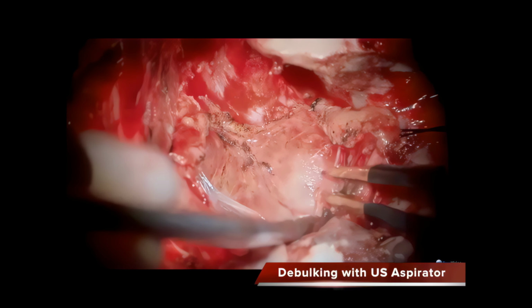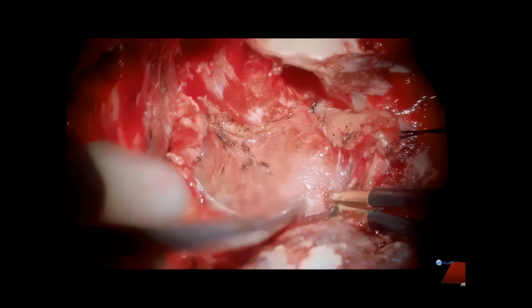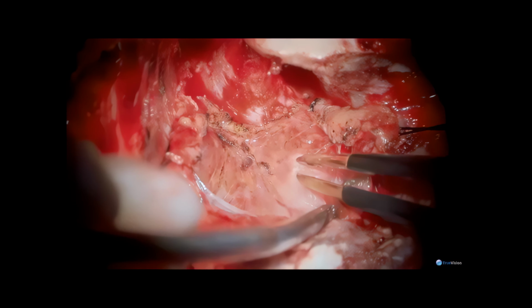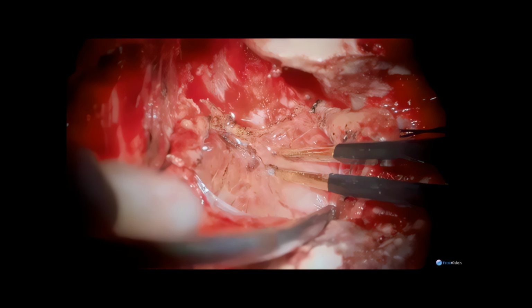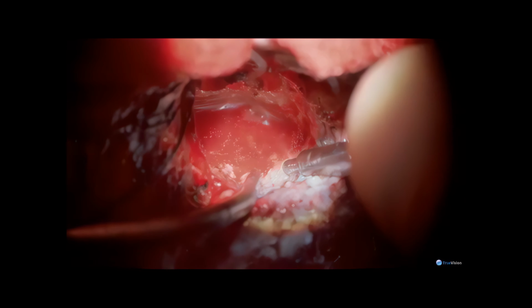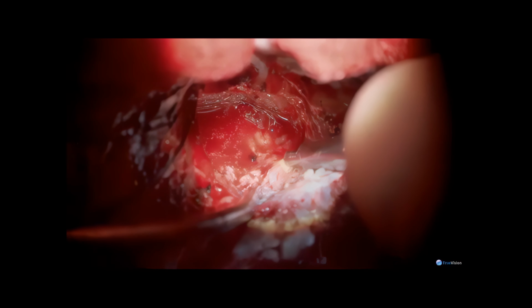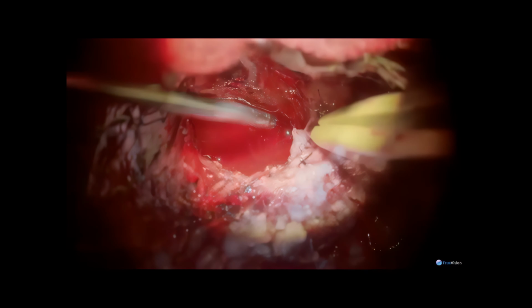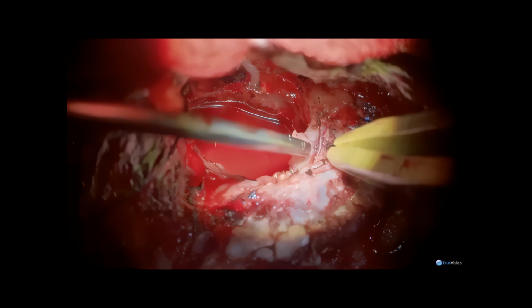The posterior fossa dura has been opened, and we are carefully dissecting the arachnoid plane off of the posterior aspect of the tumor. The tumor is then centrally debulked, leaving a thin shell so that it can be more easily mobilized off of critical structures on the brainstem and off of the cranial nerves.